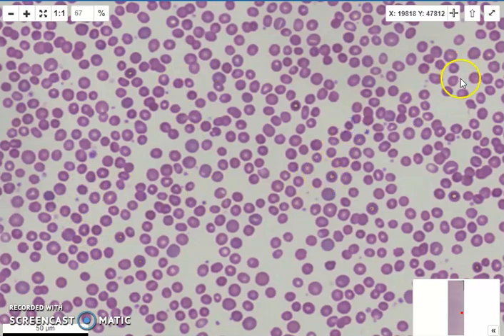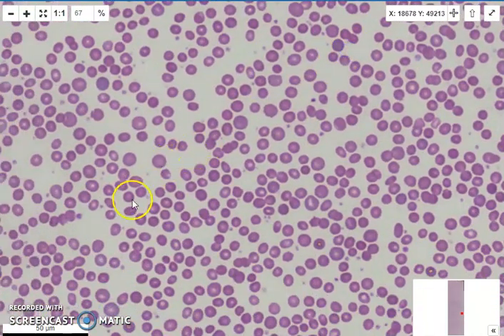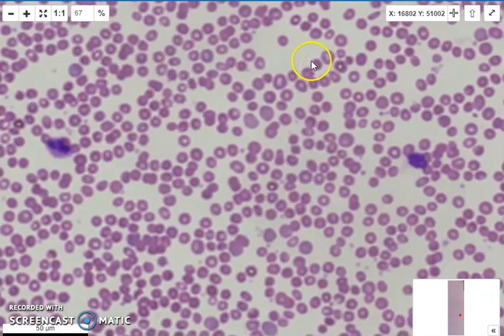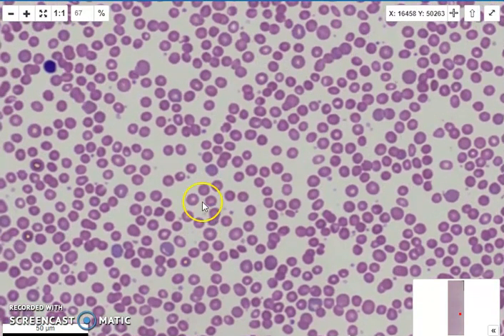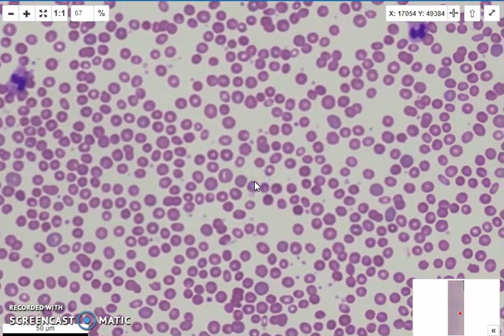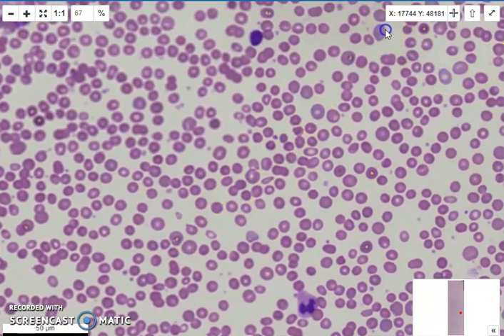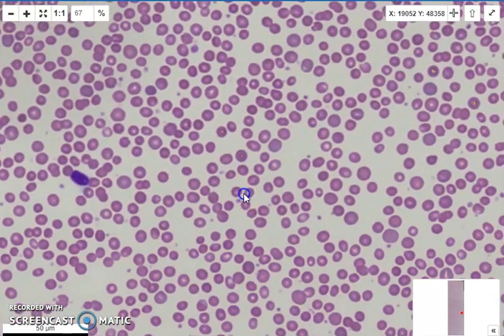Now, the reason I know this is hereditary spherocytosis is because of the degree of hemolysis here. So I have a reticulocyte response, but as I'm traveling through, I'm not really seeing that many, if any, nucleated red blood cells. And so it's not an acute hemolysis. It's not that one day I woke up and I started to hemolyze all my red blood cells. This has been going on for a long time. It's slow burning. I can still release and create reticulocytes and polychromatic cells. So I'm destroying my red cells slowly and I'm replacing them slowly.